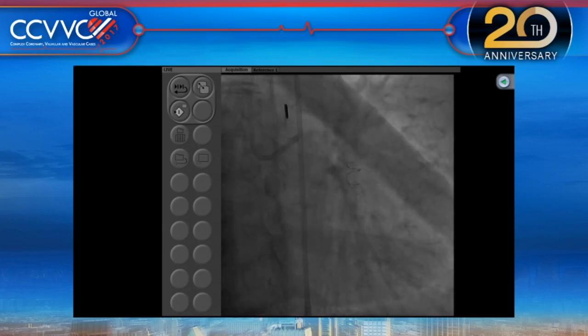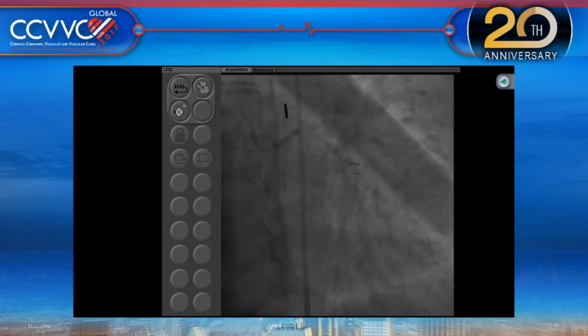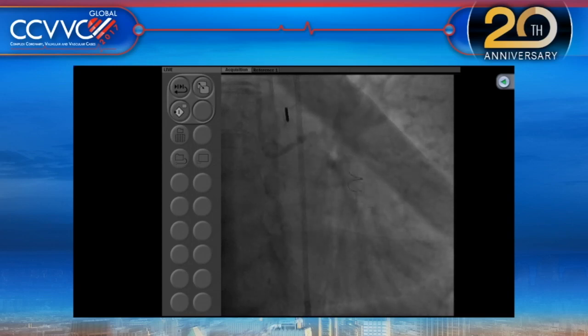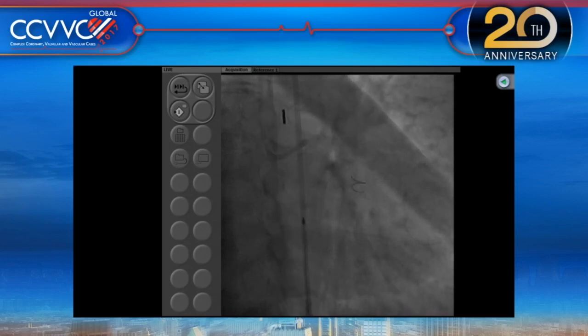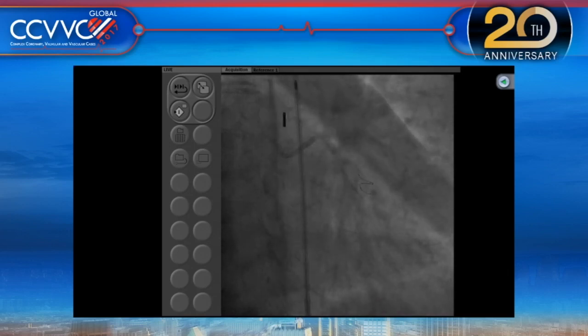She had just a very small non-STEMI, troponin positive, and we thought that if the circ closes, it will give rise to a problem acutely. Yeah. So in the RCA picture, you could see the collateral to the circumflex. Yeah, we saw that as well.